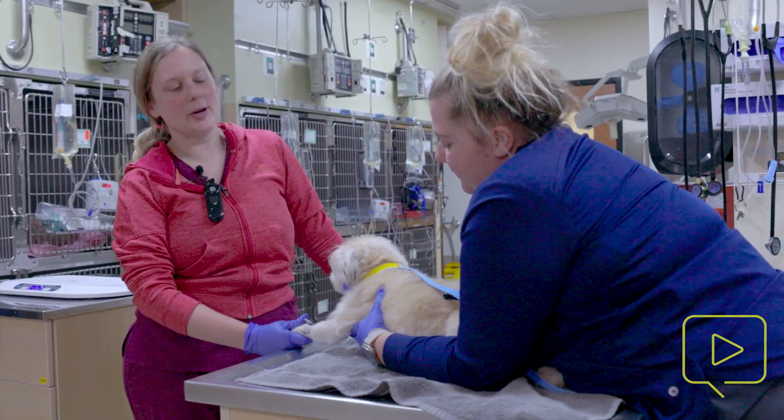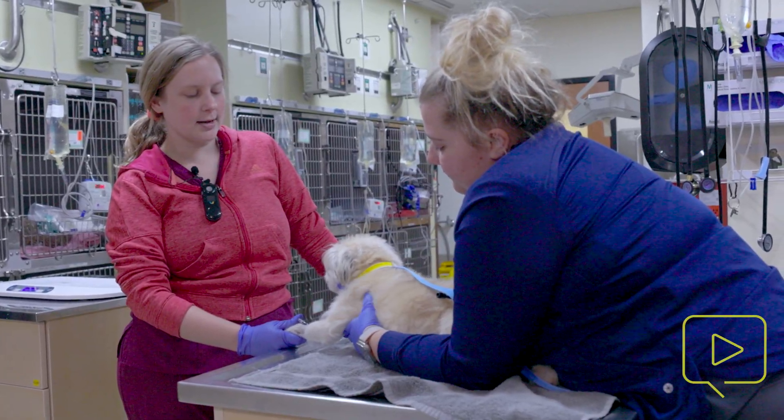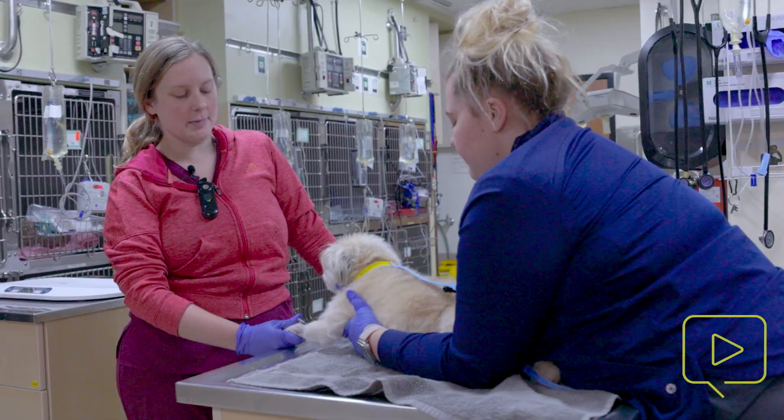Hi, my name is Courtney. I'm a technician here at Dove Lewis. Today I'm going to go over taping of IV catheters in patients.